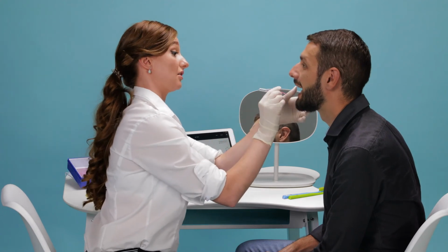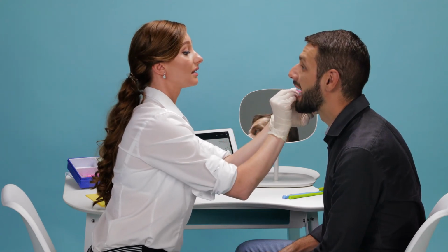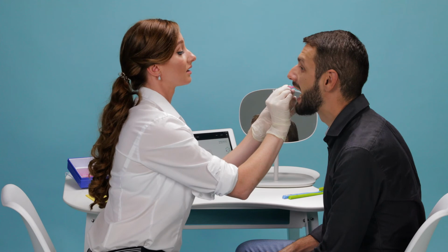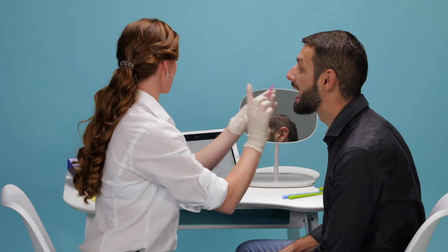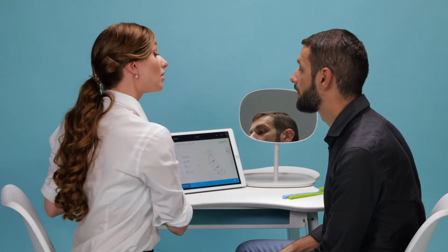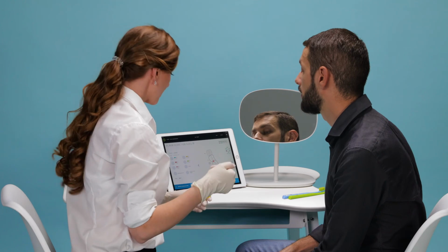We finish on the last sextant, that being the lower right. I used the pink prime brush as this was the brush colour indicated from the last score. However, today it is possible to increase the size to the yellow prime brush.